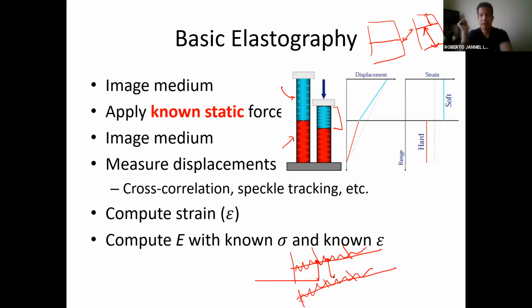The name it receives is speckle tracking: tracking of the speckle or granulation in the ultrasound based on radio frequency data. She envisioned it for applications both in Doppler and in elastography. Because in the end, it really is the same thing. You're trying to track motion, whether because the tissue is moving or because you're actually compressing the tissue, but it's kind of the same thing.